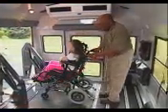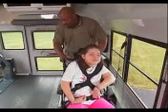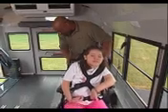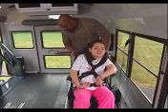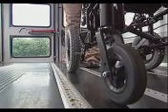Correctly securing a wheelchair is extremely important for the safety and comfort of the passenger as well as for your own peace of mind. Injury or death may result from improper securement. With the occupant facing the front of the vehicle, center the wheelchair between the floor tracks.